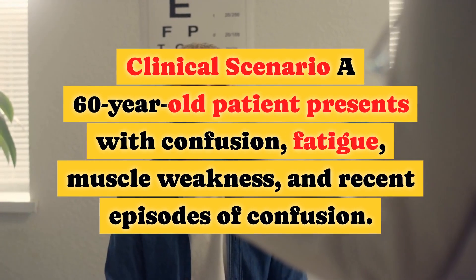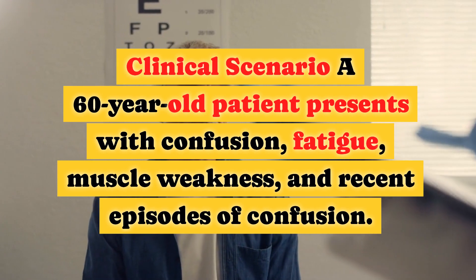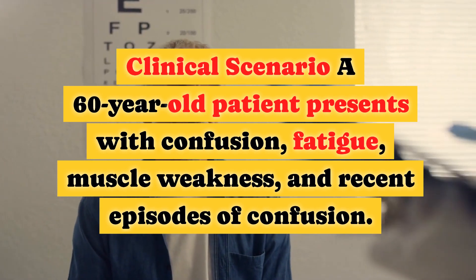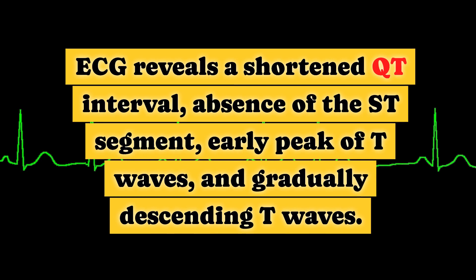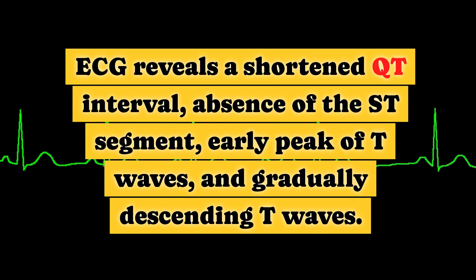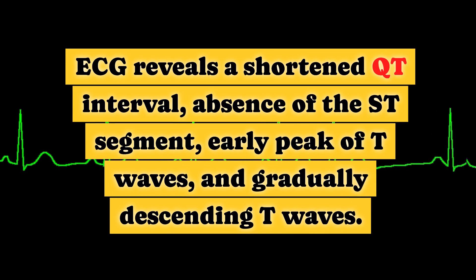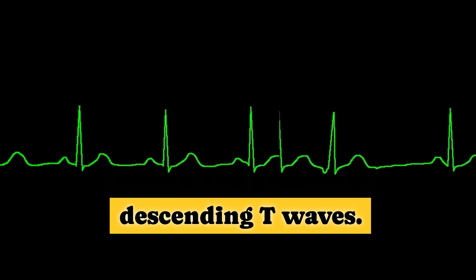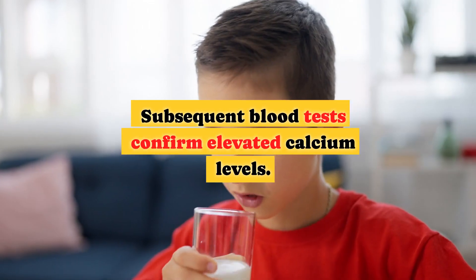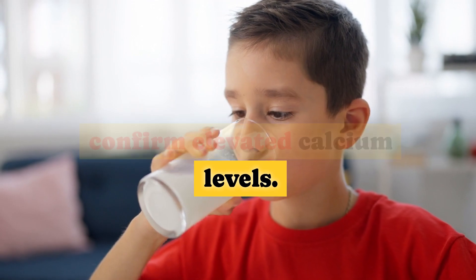Clinical scenario: A 60-year-old patient presents with confusion, fatigue, and muscle weakness. ECG reveals a shortened QT interval, absence of the ST segment, early peak of T waves, and gradually descending T waves. Subsequent blood tests confirm elevated calcium levels.